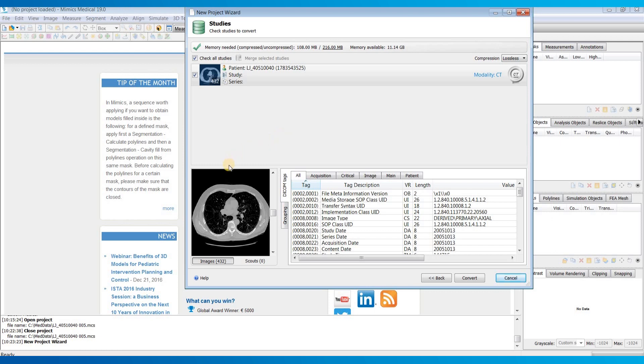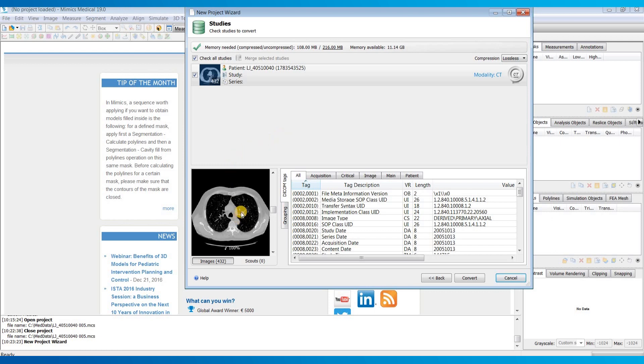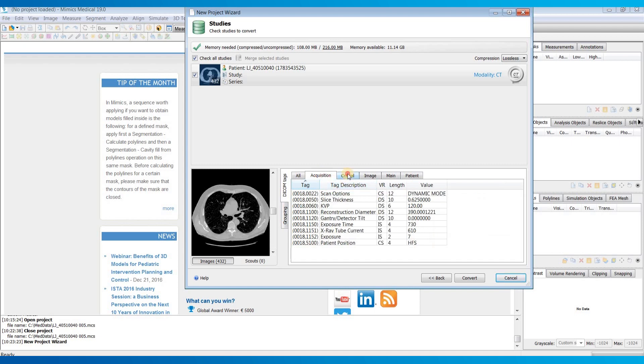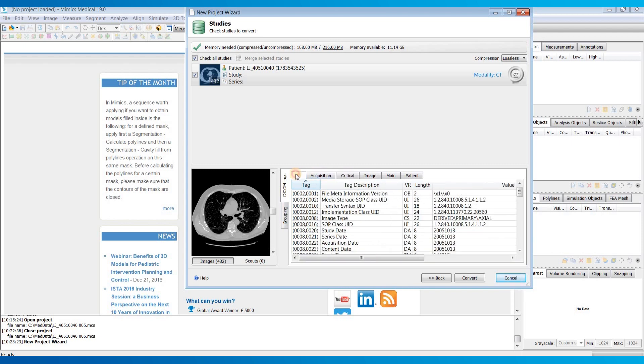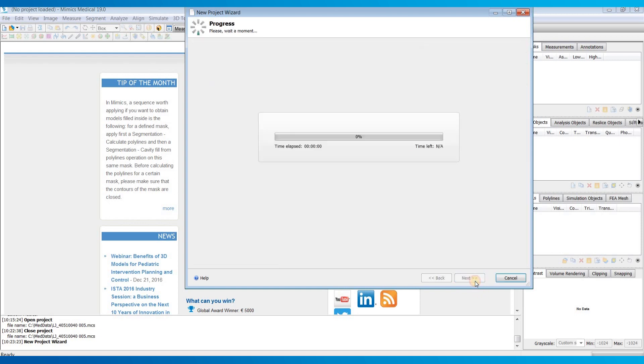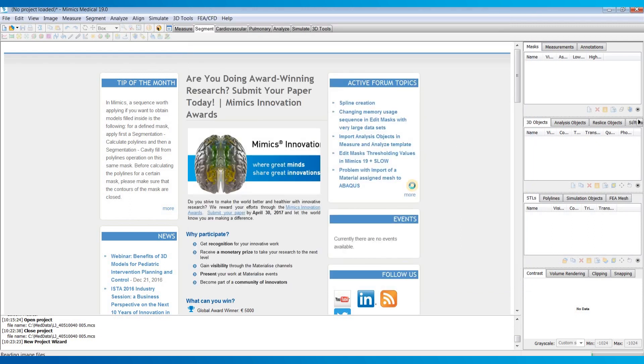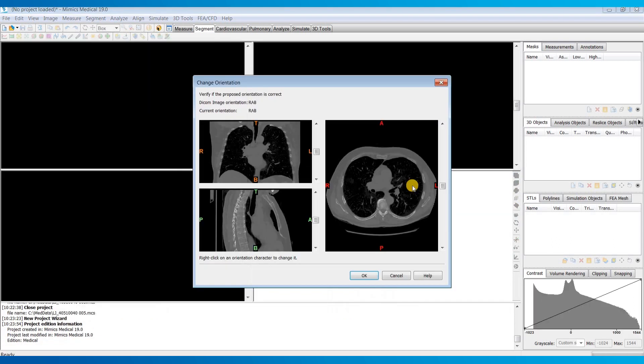This will bring you to a screen where you can see a preview of your images as well as look at all of the information in the DICOM headers. Once you select the study that you want to import you can hit convert. This is going to convert it into a Mimix project file or .mcs which is going to contain all of your images as well as any work that you do to those images.